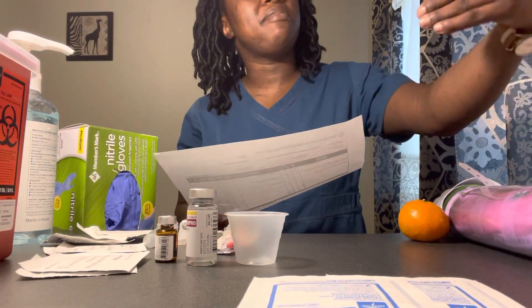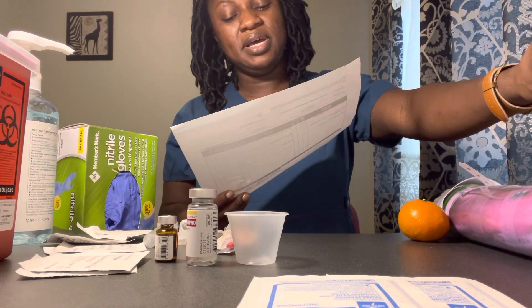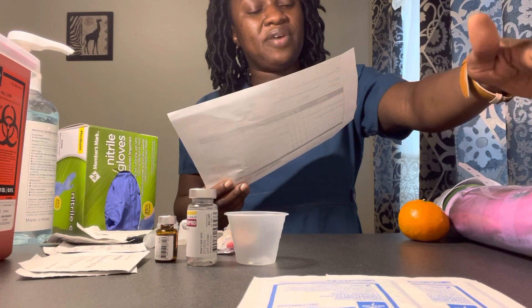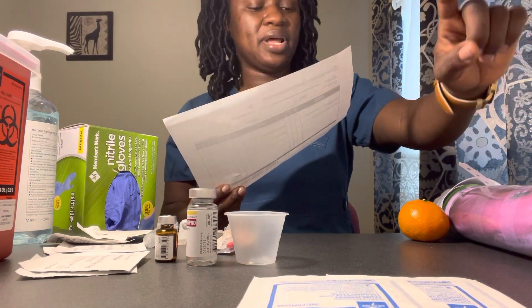Let me go ahead and pull up my MAR. I have my MAR pulled up. I have my patient Millie Larson, date of birth 1-1-1936, and no known allergies on here. Looking at my MAR, no known allergies — that is correct. First medication: haloperidol two milligrams intramuscular to control agitation. That's what I have.